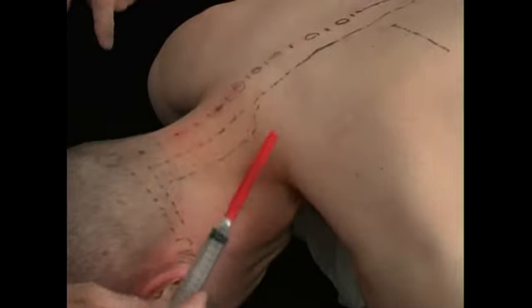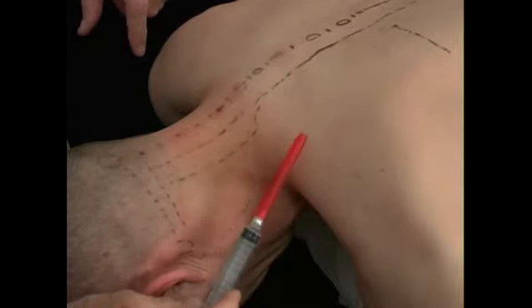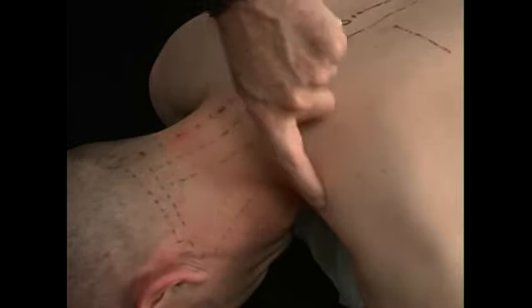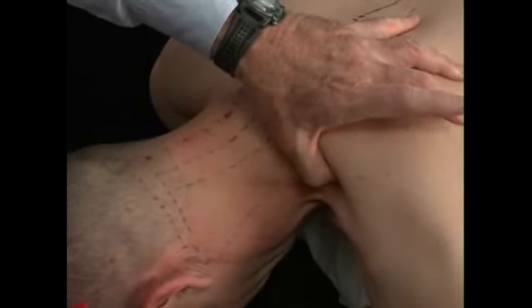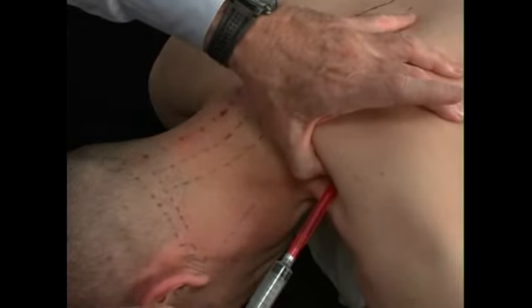We want to maintain our backward direction with the needle, so we're aiming dorsally on the patient and upwards so that we don't slide into the apex of the lung. The second rib lies in the trapezius, right in here. The scalenes come off of this area, so this first and second rib are important ribs to hit. And again, with our needle aimed backwards and upwards, we come into that second rib.